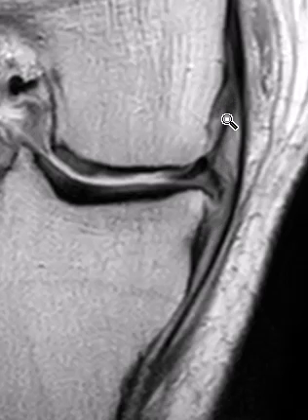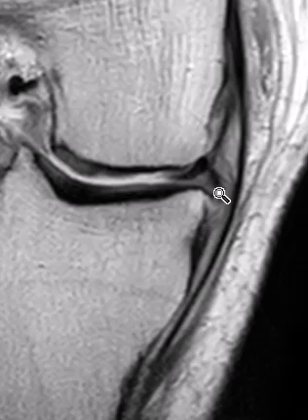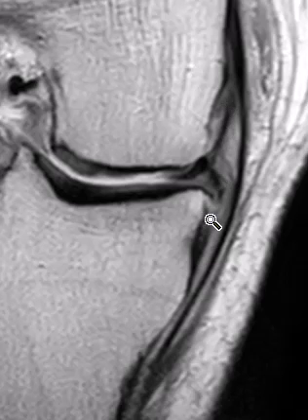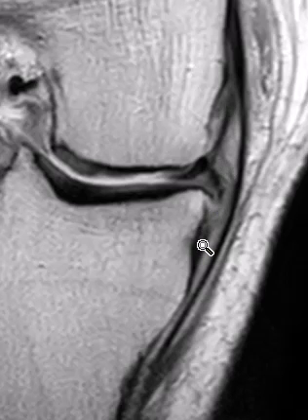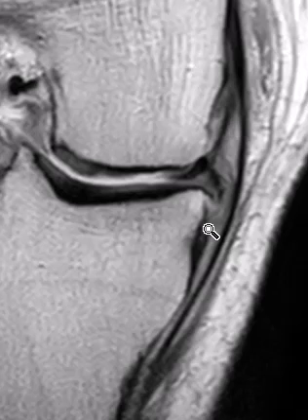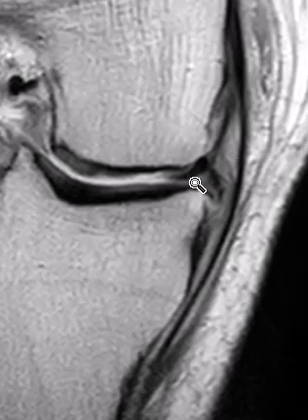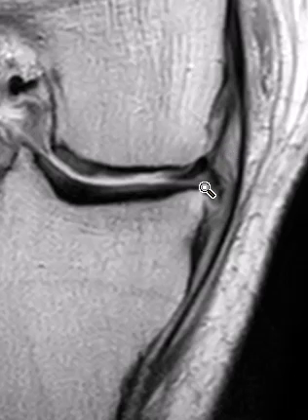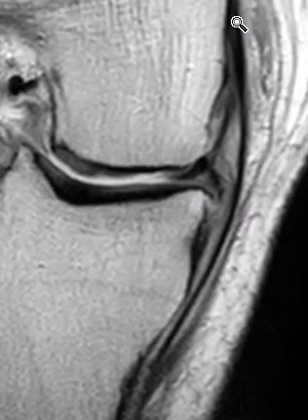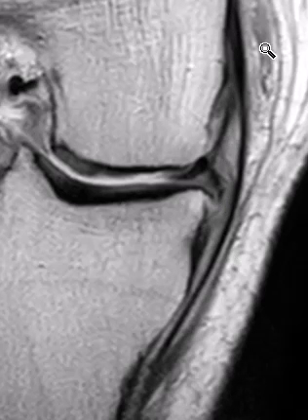These patients always have a tear of their meniscocapsular junction. The meniscus body is adherent to the inner fibers of the medial collateral ligament — we call them the inner capsular fibers or joint capsule — and so they have a tear of the meniscocapsular junction, tearing these inner capsular fibers because that meniscus is torn outwards and it's adherent. You can see over here the outer fibers of the medial collateral ligament are nice and thick — those are intact.